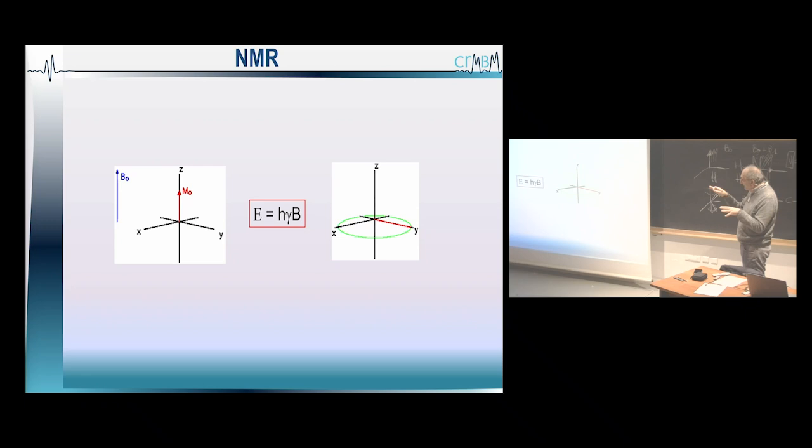Until now, we have nothing. We need to wait for what we call the relaxation. So relaxation means that you are going to suppress the B1, so you're going to go back in here. Just the opposite, you're going to have different numbers of nuclei in the different levels, but it's going to change with time. And this is this change that you are going to record.